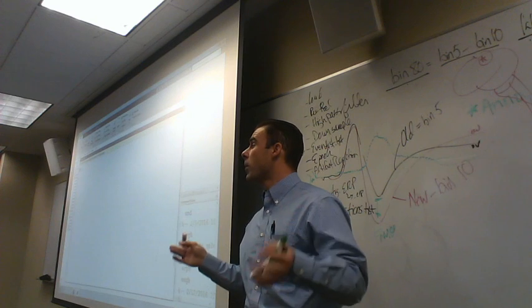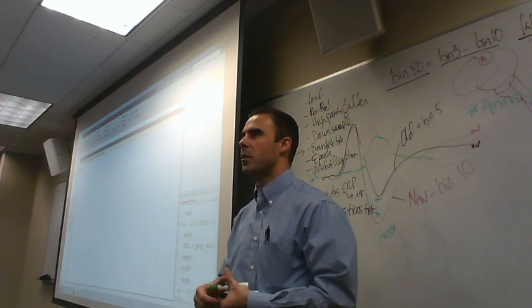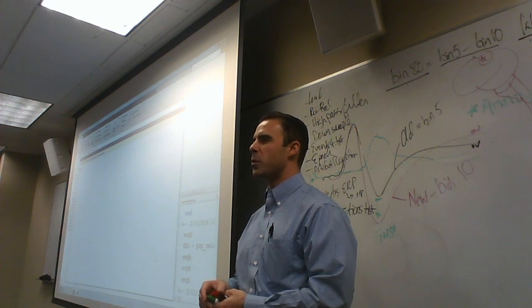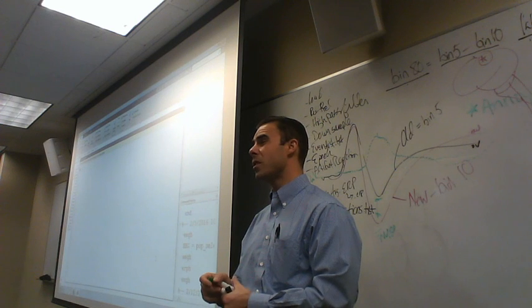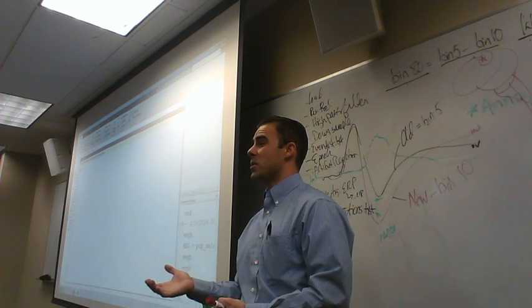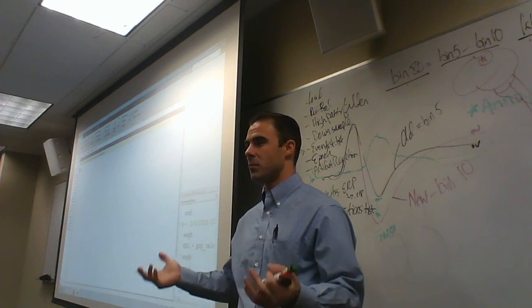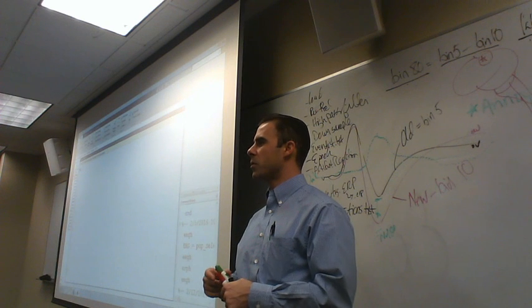Now, to be fair, there are people who claim that they can devise some types of equations and algorithms that try to address that. It's called source localization, and there's a whole little field about that. A lot of people are skeptical about it. Not that it doesn't work in its entirety. It could end up being a fairly good approximation, but a fairly good approximation is not a definitive answer, is it? So that's where people kind of come down on that fence. You either think it's kind of, you guys remember The Simpsons?